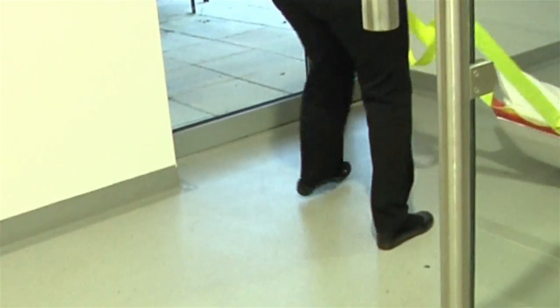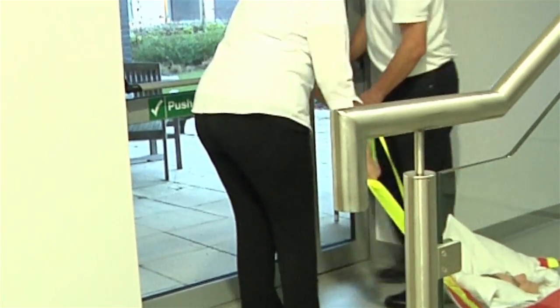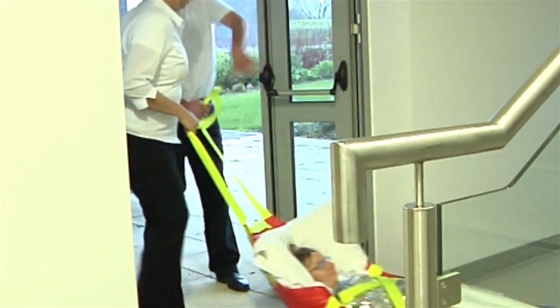Once the patient has exited the building and reached a point of safety, the cross straps can be loosened to ensure that the patient is comfortable.